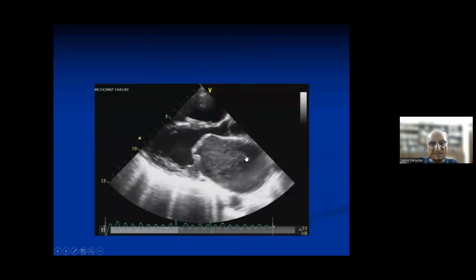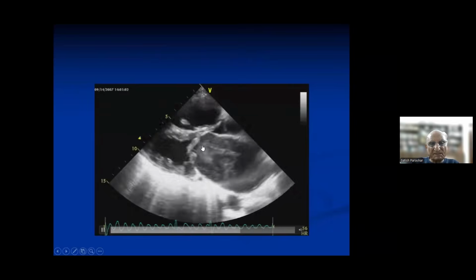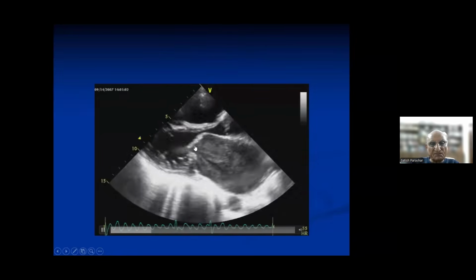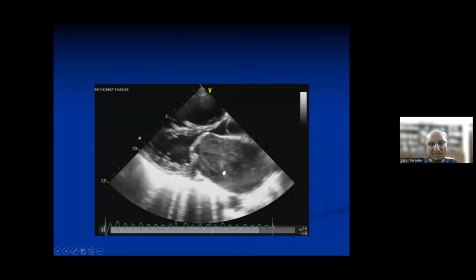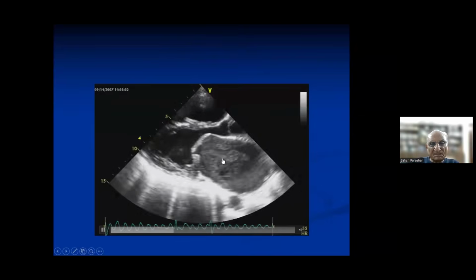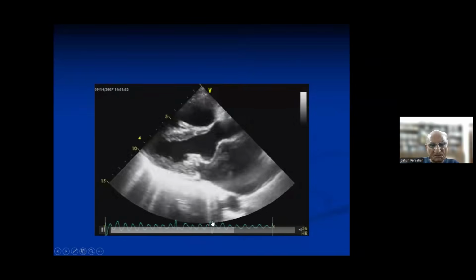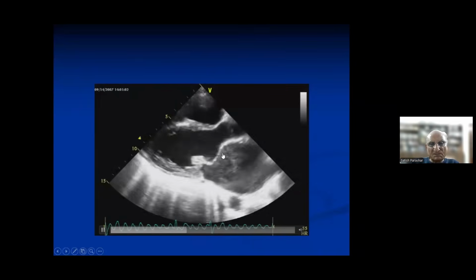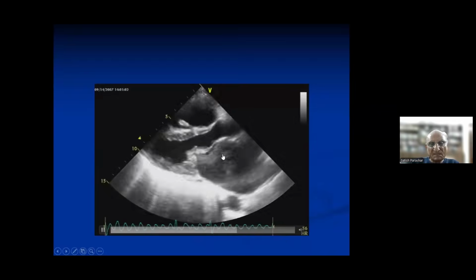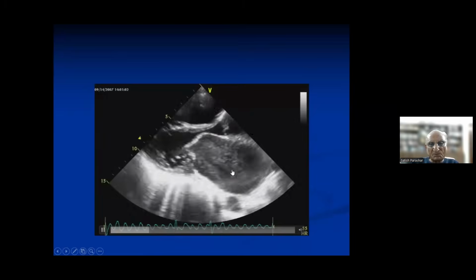Now, see this. This is a parasternal long axis view. You see a doming of the mitral leaflet with a convexity toward the left ventricle, and the posterior leaflet goes toward this. And this is known as a spontaneous contrast echo or a smoke in the left atrium. This is because of a very slow flow state, because of atrial fibrillation, as you see in the ECG. You can see the majority of these RBCs also in a low flow state, and when the ultrasonic beam strikes against them, they produce a smoke.